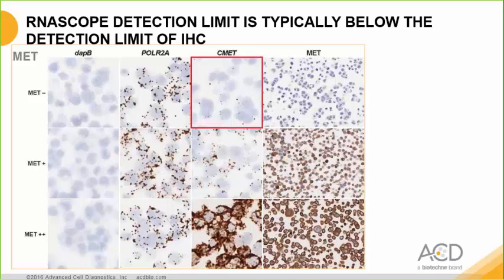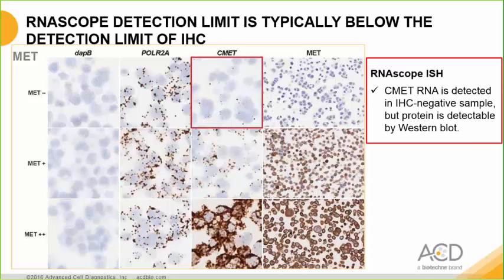However, cMET RNA is detected with RNAscope, and protein was detectable by Western blot. Could the RNAscope cMET signals be background noise rather than true signal? Well, re-examining the negative DapB control stain slide here in this field that has no staining whatsoever reassures you that the signal in the cMET stain slide is real. And RNAscope technology was able to pick up low-level expression that IHC was unable to.